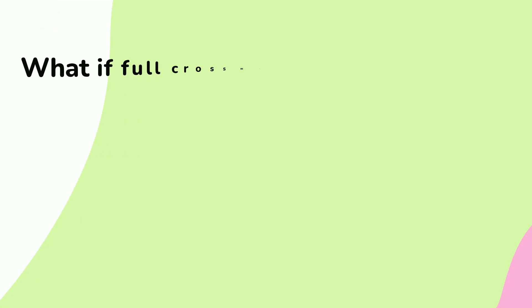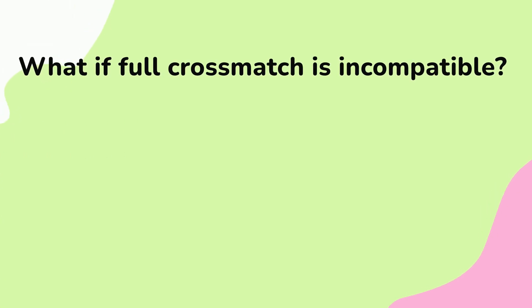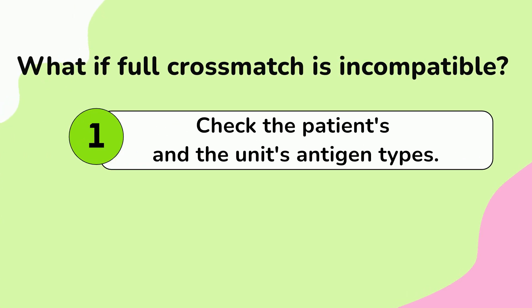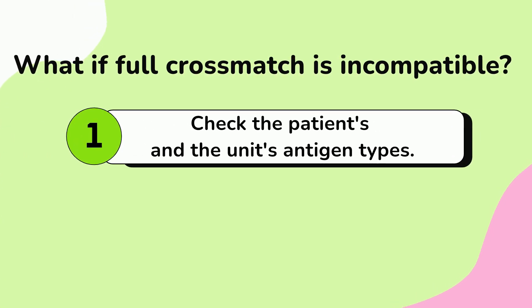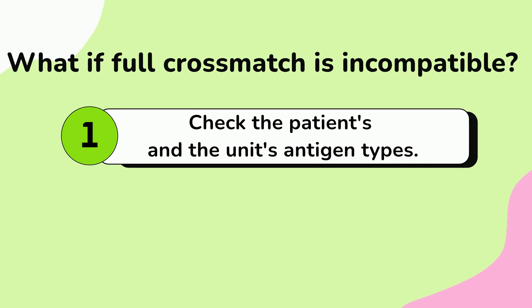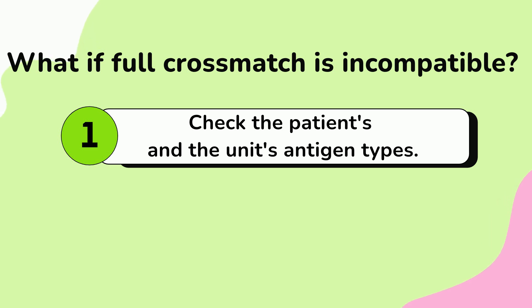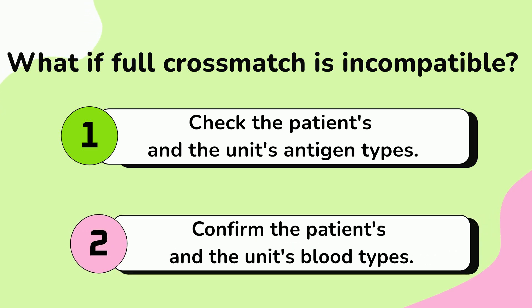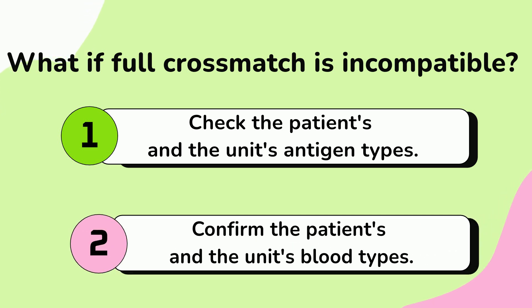What if the full crossmatch is incompatible? You will have to make sure that the unit you selected for crossmatch with your patient is antigen negative for the antibody that your patient has. This can be very difficult, especially when your patient has multiple antibodies. I explained how to calculate how many units you need to screen for antigen-negative in my previous video — please check it out at the end.